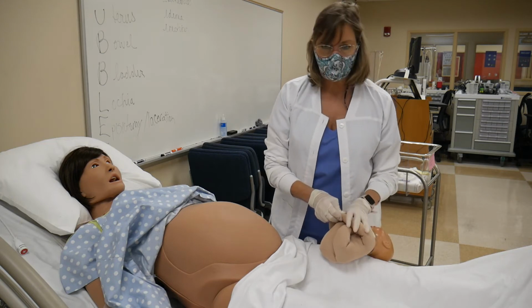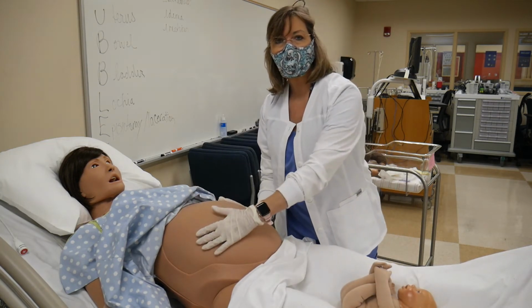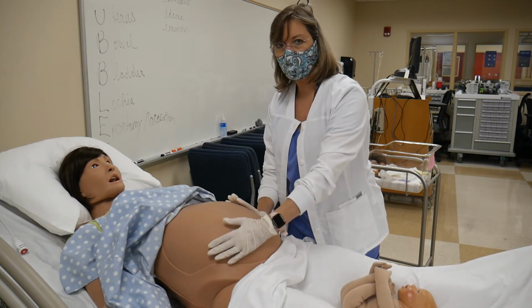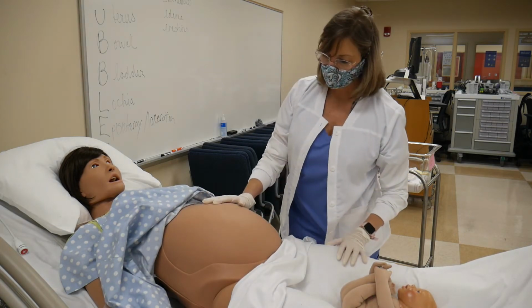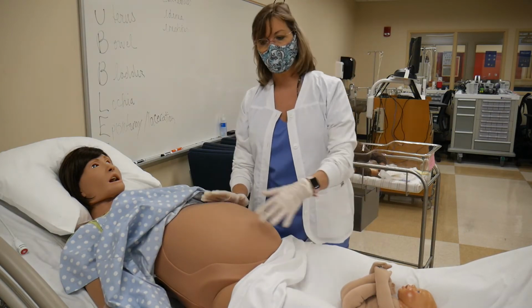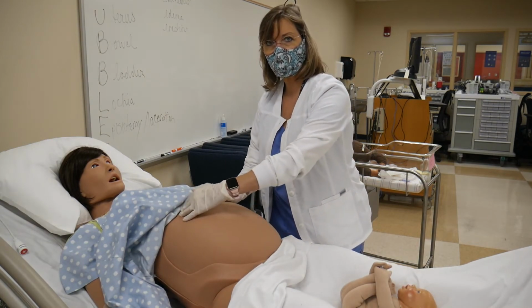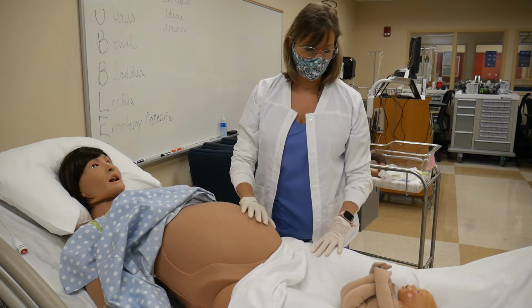But sometimes we have moms that are very slender, and sometimes we have moms that are a little bit fluffier, and there's a little bit more adipose between you and the baby, and it can be hard to tell. So don't be paralyzed by that. Ask the mom, is it okay if I try to feel what position your baby's in? Even if they've already got the monitor on.